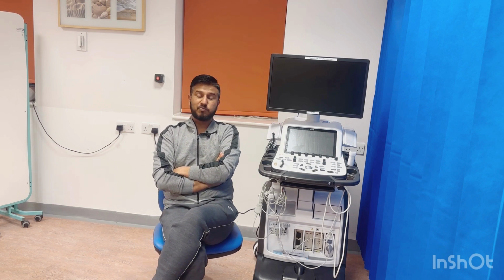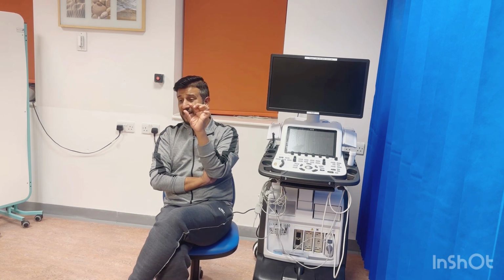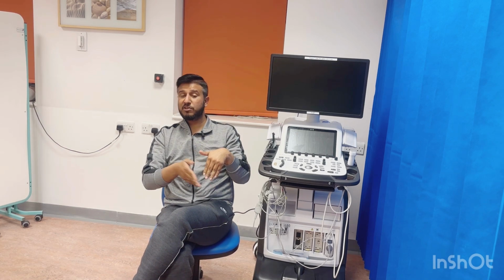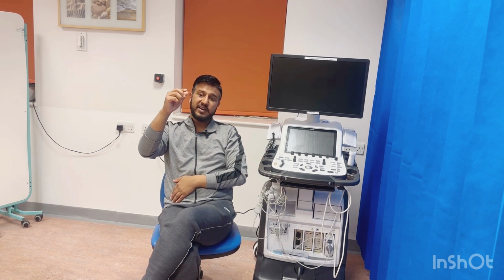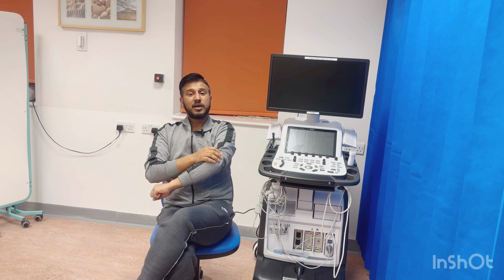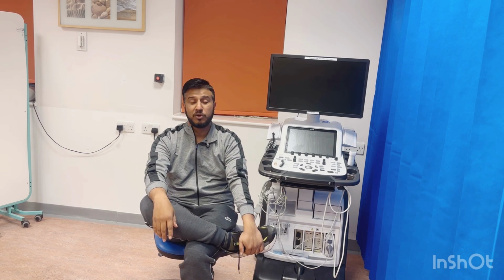I have done multiple cases where I did all my PISA measurements in the same view. In parasternal long axis, I get a very good radius. I just decrease the baseline, because the jet is coming in this direction, and I get the PISA radius, then I get the velocity. And also the regurgitant volume, when I trace the jet. So my PISA calculation was done even in the long axis view only.